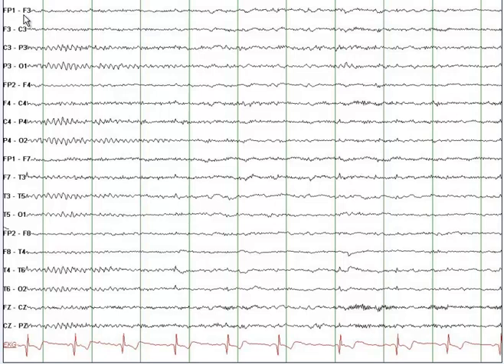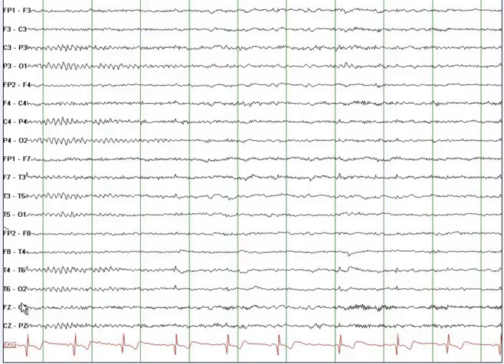On EEG, when you see an odd number in front of any of those alphabets, those odd numbers record electrical activity from the left side of the brain. Where you see even numbers, those are recording from the right side of the brain. And electrodes ending with Z are recording from the midline.